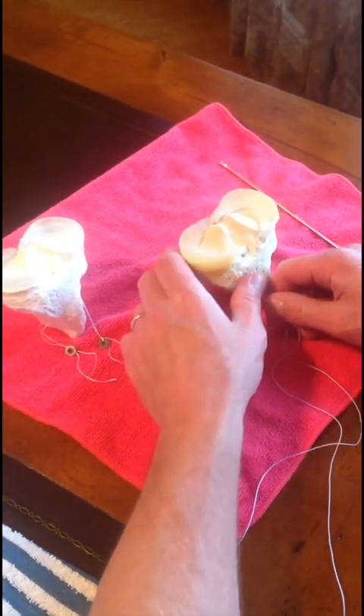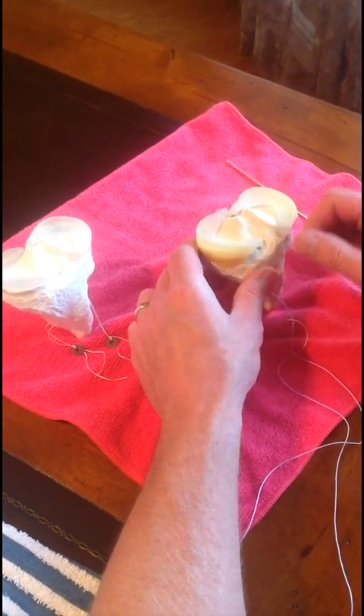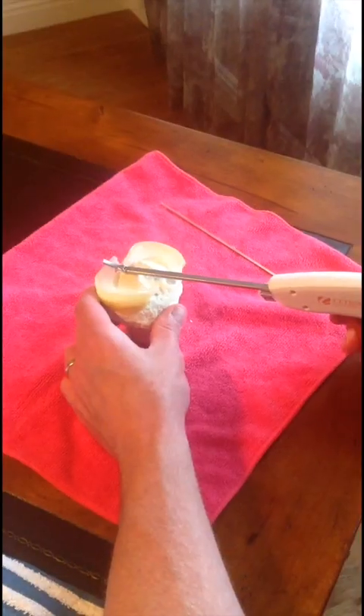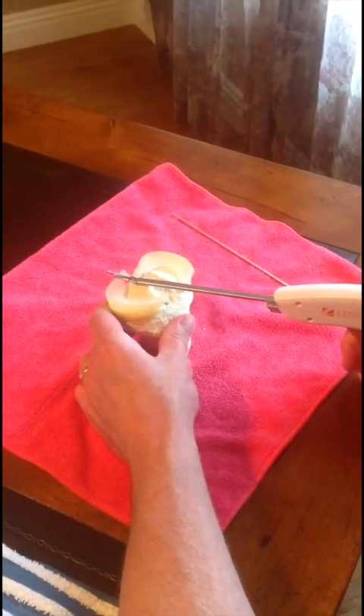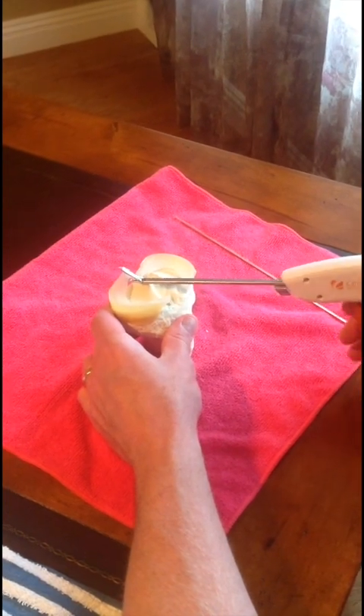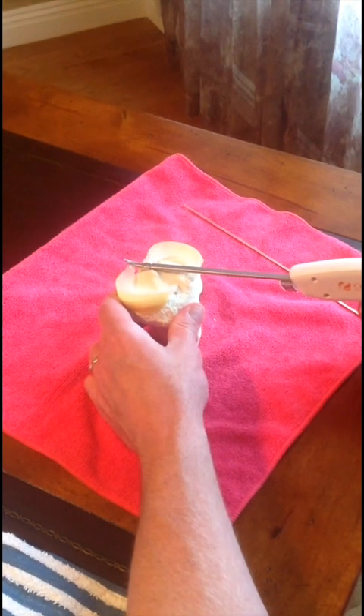With commercially available anchors you simply drill your pin so that you can pass your suture with it, then go ahead and drill and/or tap your socket for your suture anchor. Because once you place your graft passing limb up there you can't tap it — you run the risk of cutting that passing suture itself.